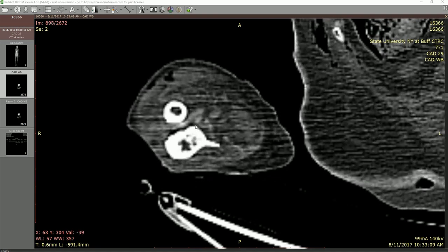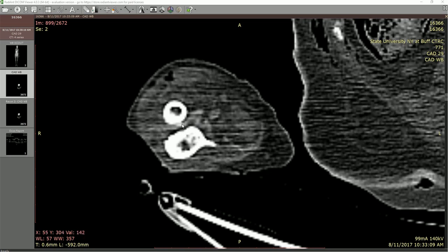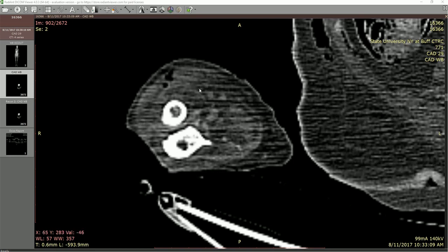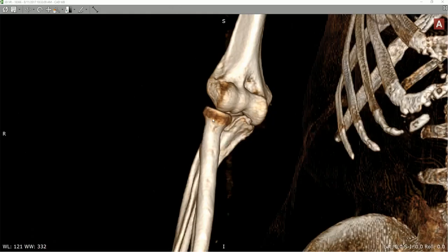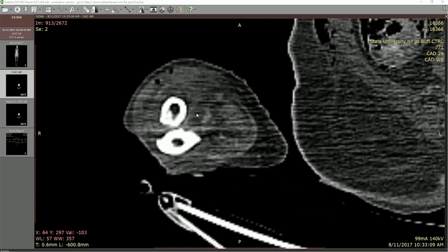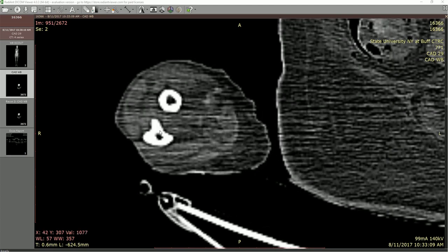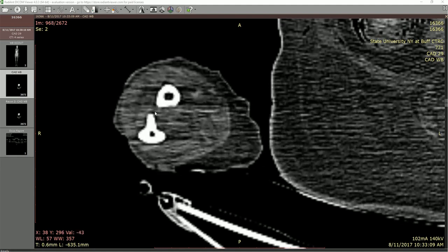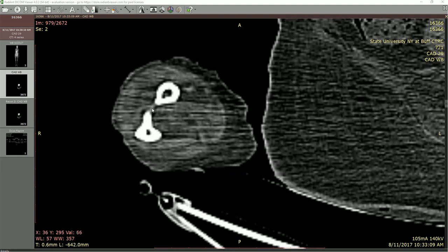Continuing further down, we get proper separation of the radius and ulna, and we're going to start to see the interosseous membrane. This is going to be the anterior compartment and this is going to be the posterior compartment. Remember that we have pronation, so the anterior compartment is actually going to be seen medially and the posterior compartment laterally in this perspective. We can see the ridge of bone on the medial and lateral surface where the interosseous membrane interconnects these two bones. We actually get a nice little view of the interosseous membrane within this space — you can clearly definitively see that line interconnecting those two bones.